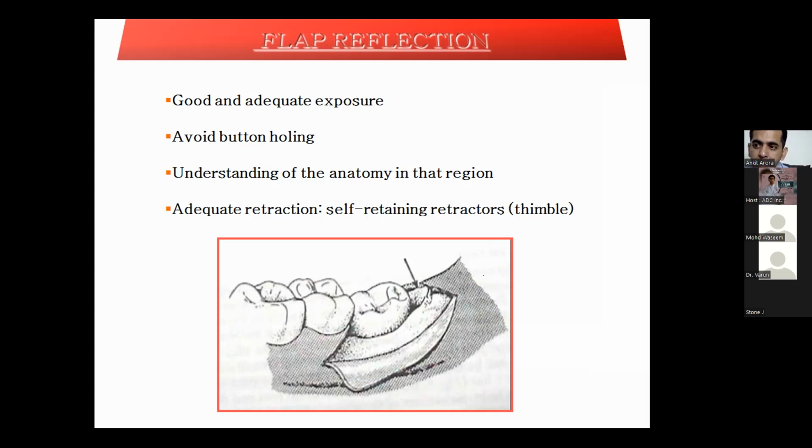And I wait specifically for 8 to 10 minutes. That helps me achieve two basic purposes. First, it completely anesthetizes that area. Obviously, we do not start before the anesthesia takes its complete effect. And second, for hemostasis, the 1 to 2 ml of local anesthesia we give allows for a cleaner surgery, which you will be seeing in the coming slides also. So this simple maneuver of giving an ample amount of local anesthesia helped me get a good surgical flap, which lays the foundation of a good surgery.